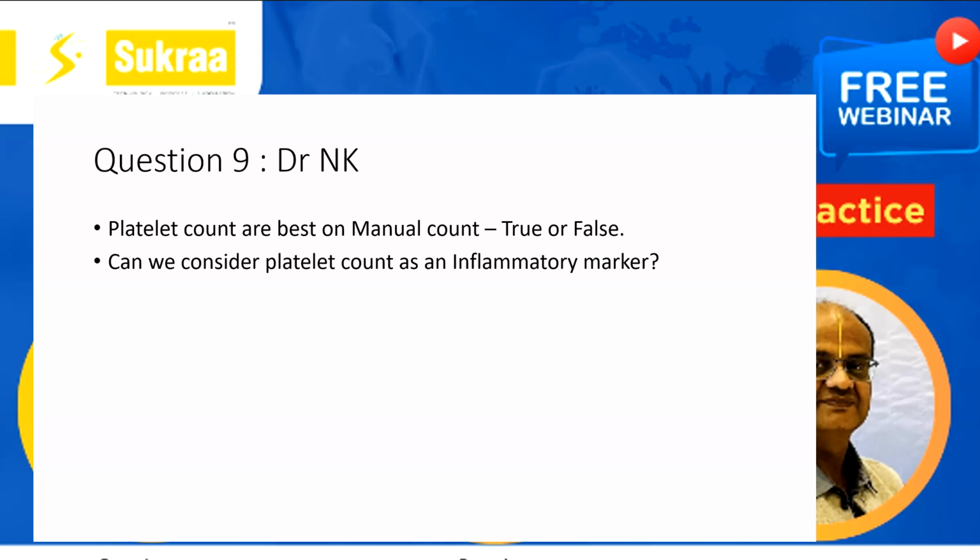And if you have EDTA-associated pseudothrombocytopenia, then one has to collect it in a citrate tube, and then analyze the platelet count. Suppose you don't have access to the citrate or the patient, I think a smear review, as you told, will be able to show whether there is clumping of the platelets itself. That's beautifully explained. That's great. So we'll go to the next question.